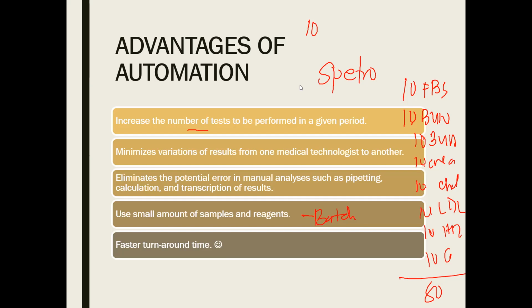Let's assume that an FBS, no, kasi meron ka pa siyang incubation period. Okay, may incubation period ka pa bago mo ilagtingan ang iyong absorbance. Kasi bakit? Because of, depending on the principle of the test. If that is an enzymatic one or kinetic, usually kapag enzymatic, kailangan mo siya ng incubation period. And incubation period takes time. No, it can last for more than 5 minutes.